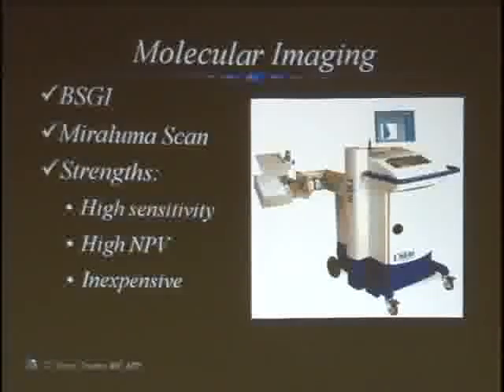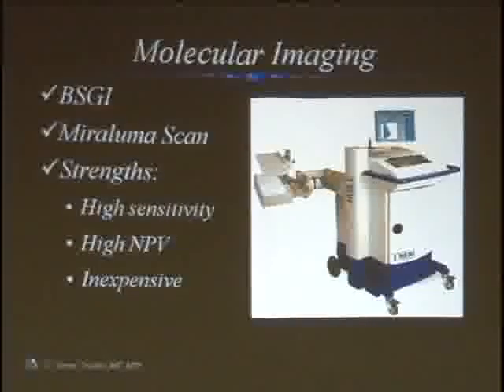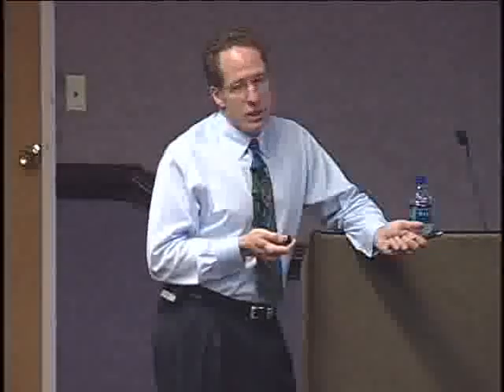What it does not mean is that when it's positive, we all know what we're talking about. It just means that when it's negative, it's really good. Okay, really good. But it's not always negative. It's inexpensive. It's many times less expensive than MRI. And we're going to talk about cost, but it's many times less expensive than MRI, which is why it's gaining popularity, because it has a lot of the properties of MRI in its sensitivity and specificity and negative predictive value, but it's 5-fold less. Okay? And it uses light compression.